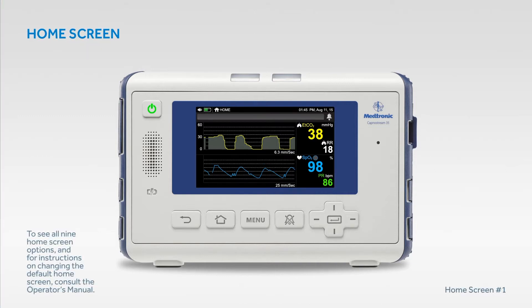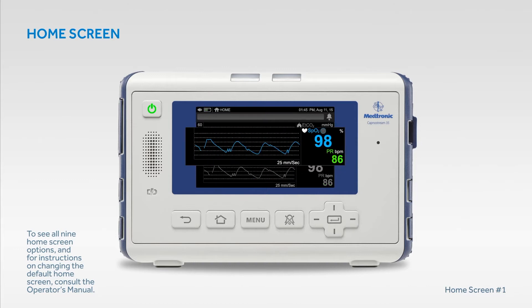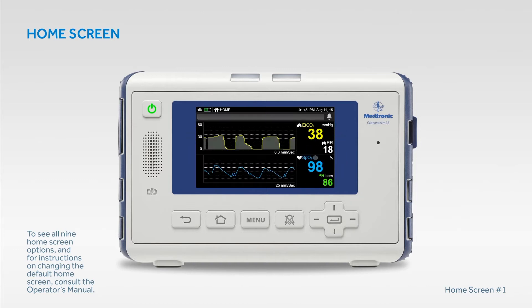The default home screen includes CO2 and SpO2 waveforms. However, there are nine different screen display options to choose from. Use the left and right directional arrows to toggle through options. To see all nine home screen options and instructions on changing the default home screen, consult the operator's manual.